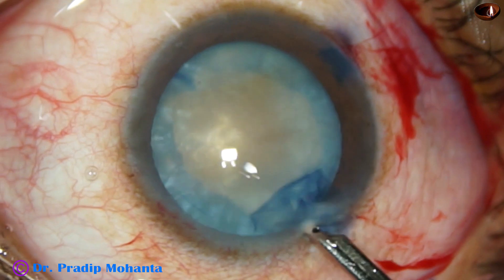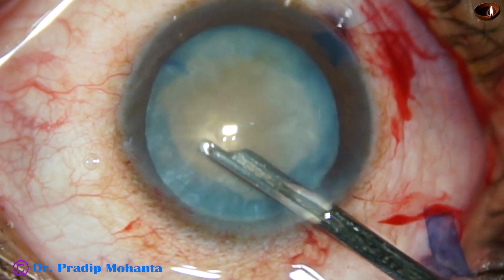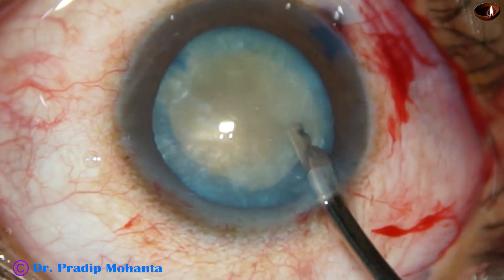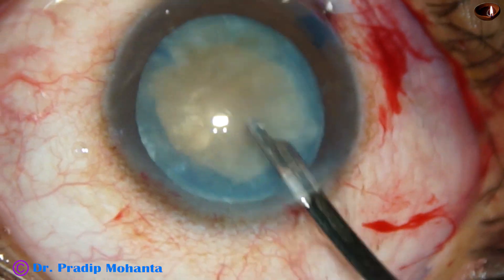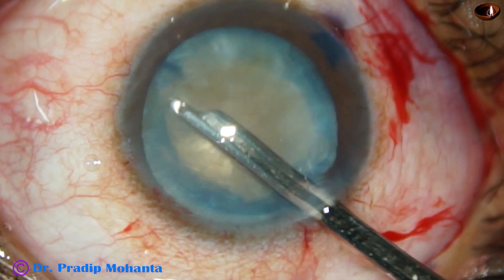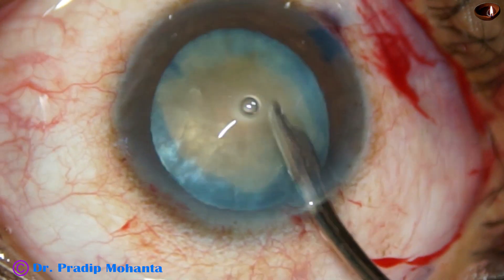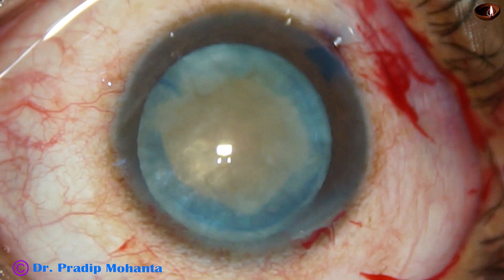The fibrous anterior capsule comes out. Now I rotate the nucleus with the Simcoe itself and aspirate some cortex. Now the nucleus is to be managed.